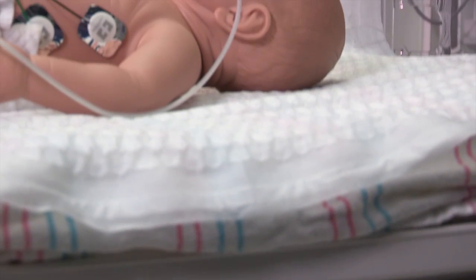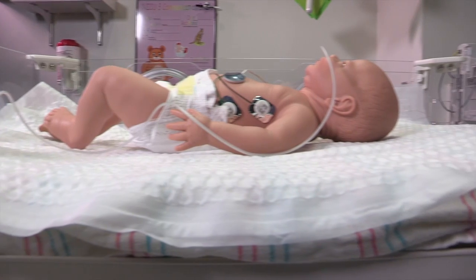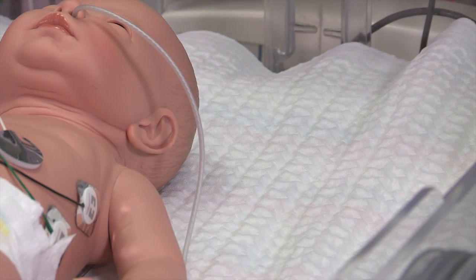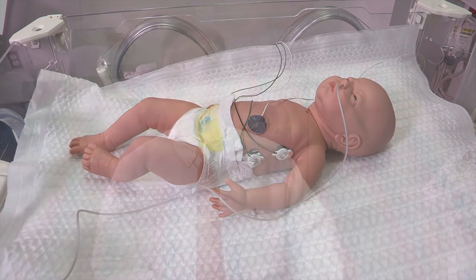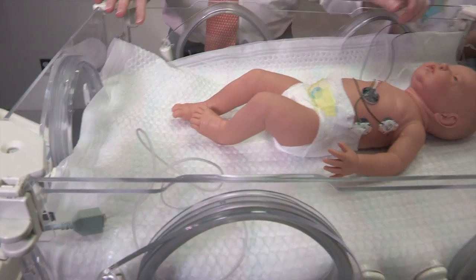We then place the baby on the cooling mattress. This mattress actually maintains the temperature of the baby at a colder temperature than normal. So instead of 98.6, we're shooting for about 91 degrees. And we use this very thin, very low-tech blanket to maintain this temperature.